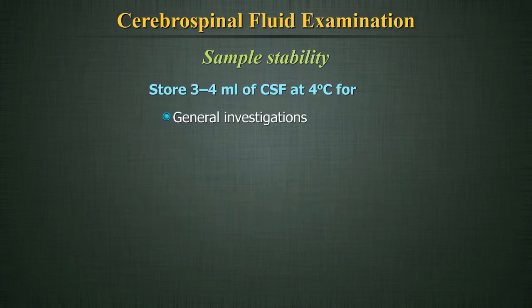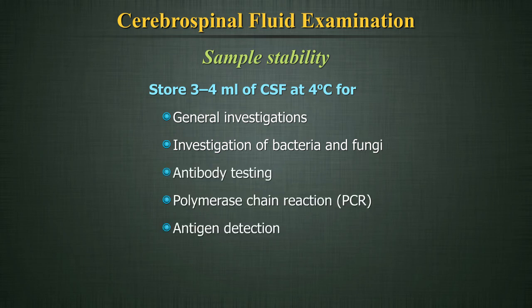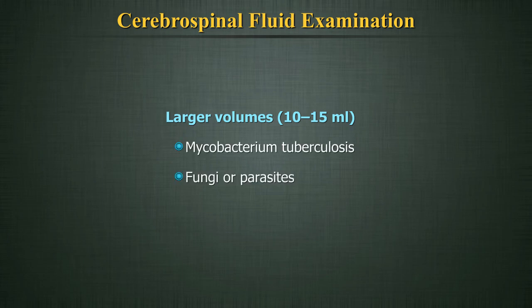This is for general investigations, investigation of bacteria and fungi, antibody testing, polymerase chain reaction, and antigen detection. Larger volumes, 10 to 15 milliliters, are necessary for certain pathogens like Mycobacterium tuberculosis, fungi, or parasites.